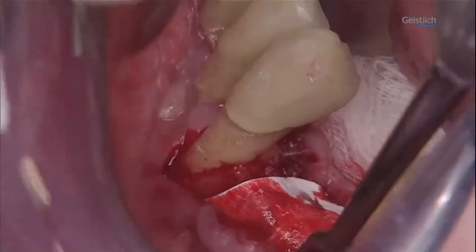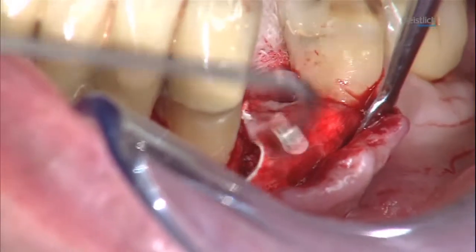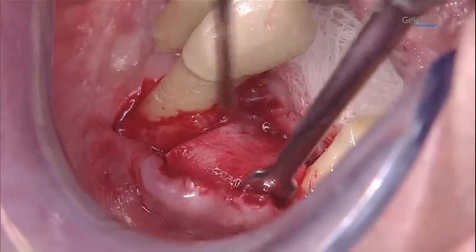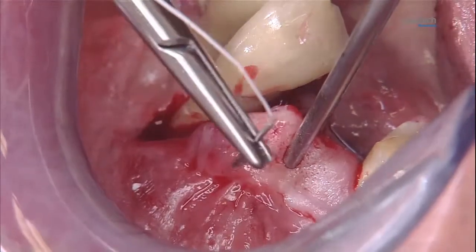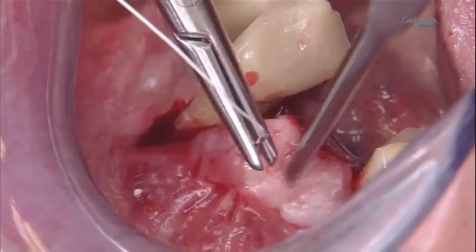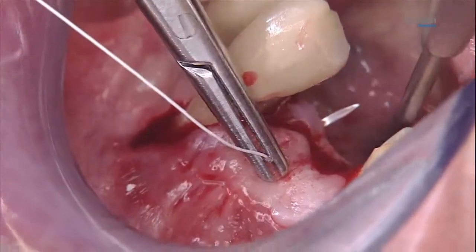Here we have created a small disc shape, which, after its introduction into the defect region, may be further shaped and pressed into place with a suitable instrument, such as a bone rasp. The Geistlich Bio-Gide membrane is then laid over the Geistlich Bio-Oss Collagen. It covers the defect and is wetted with sterile saline. The tip of the membrane is pushed under the lingually mobilized flap.